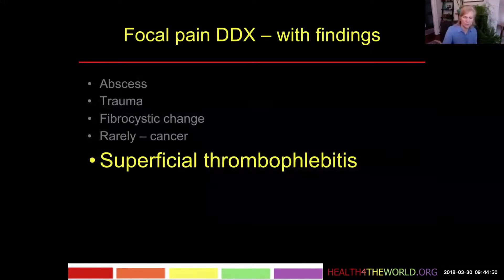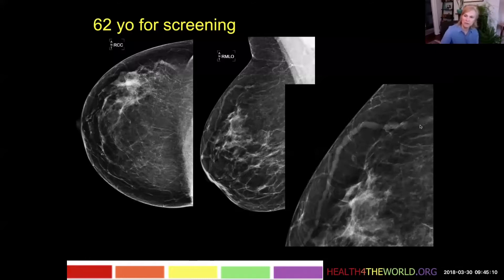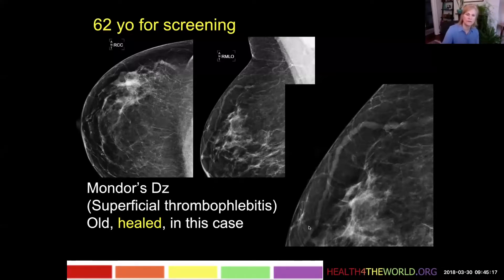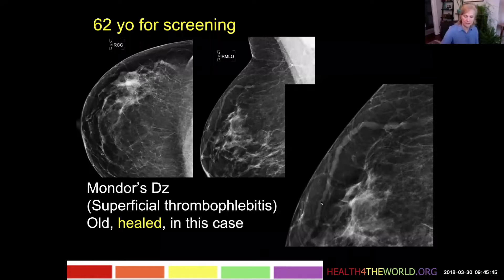Lastly with focal pain, we'll talk about superficial thrombophlebitis. This 62-year-old came for screening, and here we see a beaded linear structure where you would normally see a vein, but it's thicker and more beaded than usual — a necklace-like appearance. This is the more chronic, healed phase of Mondor's disease. Mondor's disease is superficial thrombophlebitis: a benign, self-limited thrombosis of the veins, usually in the upper outer quadrant of the breast, just under the skin. After resolution, they may become normal entirely or remain a little thick and beaded.